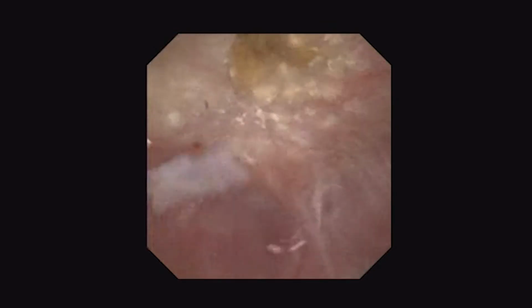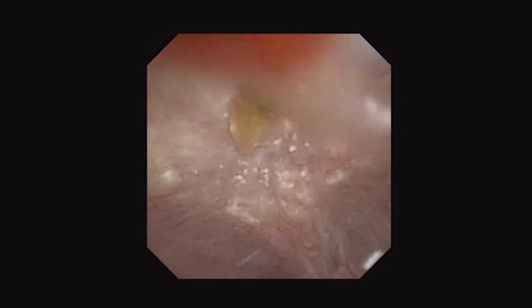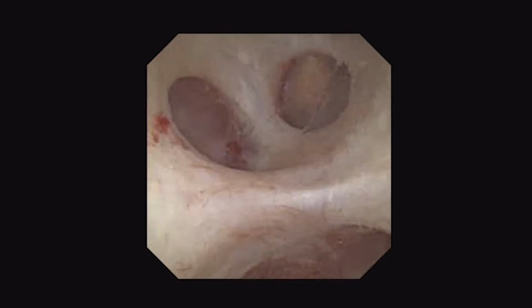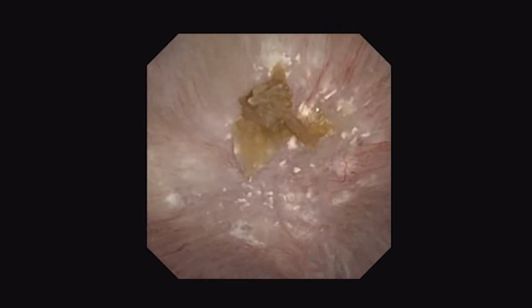So here's a kidney, and this is commonly what we do at the beginning of any stone procedure. We'll take our scope, preferably our digital scope, and we'll just march out and map out the kidney from the top to bottom. And you can see that these are the renal papillae. And at the center of the papilla, you see that kind of white-colored, kind of snow-covered mountain appearance. That's plaque. And in most people, that won't be present. In a normal person, we won't see a whole lot of plaque. And generally, this goes along with stones. And in some cases, commonly you can actually see stones attached to the plaques.